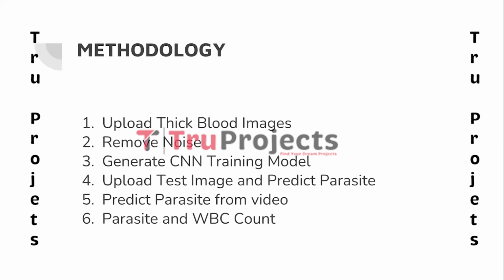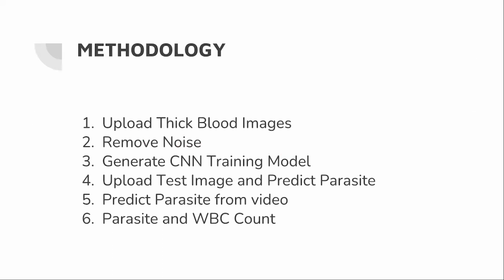And the final module is parasite and WBC count. In addition to the parasite detection, this project also involves counting the number of parasites and the white blood cells present in the thick blood smear image. This information provides quantitative insights into the severity of the infection and aids in disease diagnosis and monitoring.